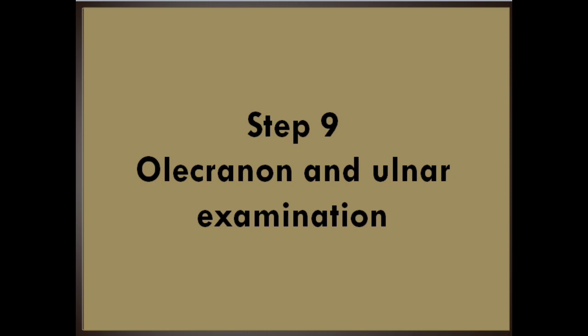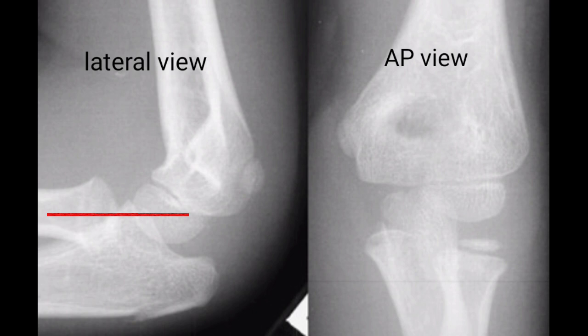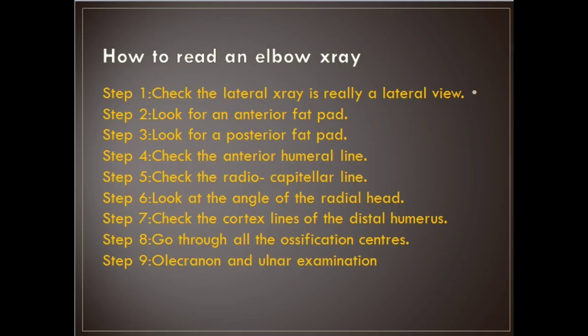Step 9: Olecranon and ulnar examination. Look for obvious fracture lines and subtle disruptions in cortical contour. This is not a good lateral radiograph, so interpretation of the anterior humeral line is unreliable. There is no obvious anterior or posterior fat pad, and the radiocapitellar line is intact. The radial head and distal humerus appear fine, while there is an obvious proximal olecranon fracture. Use this systematic approach to the elbow radiograph to avoid missing occult fractures of the elbow. Thank you and goodbye.